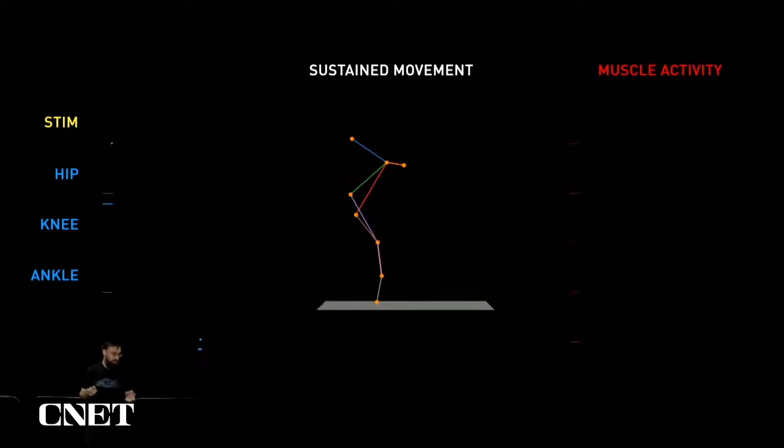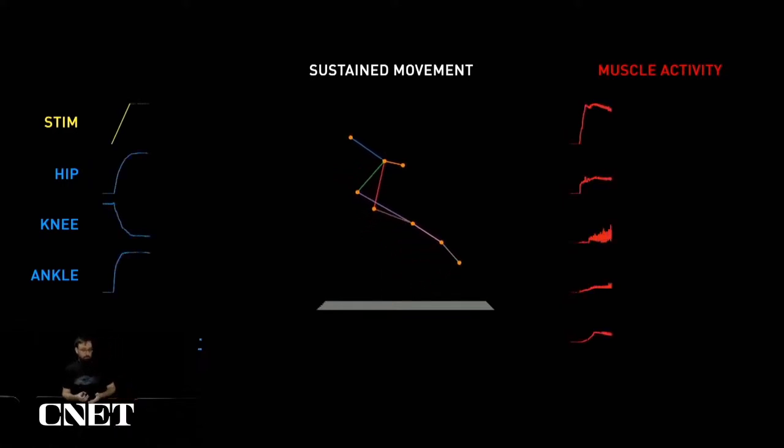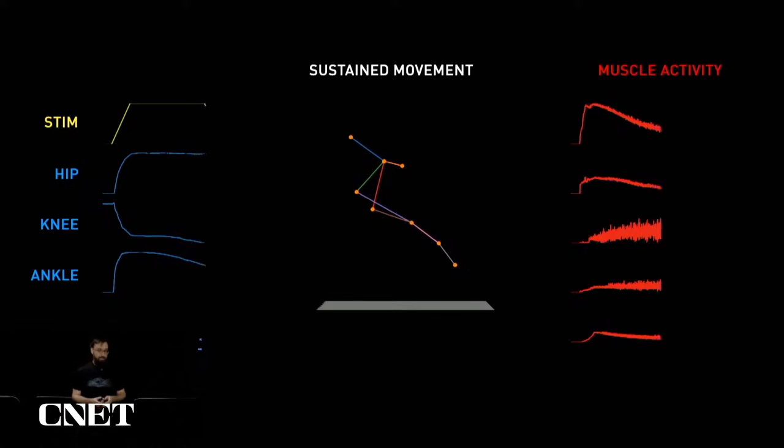So in addition to doing sequences, we can also achieve sustained movement. These are powerful muscle contractions of the sort that you might need for standing or other load-bearing activities and are really crucial for interacting through the world.